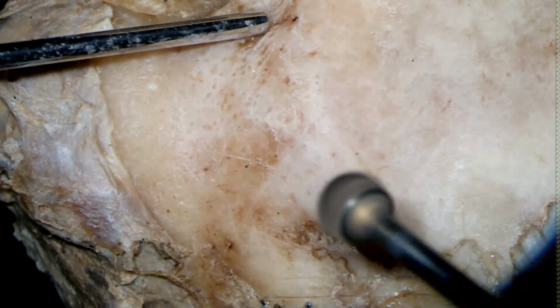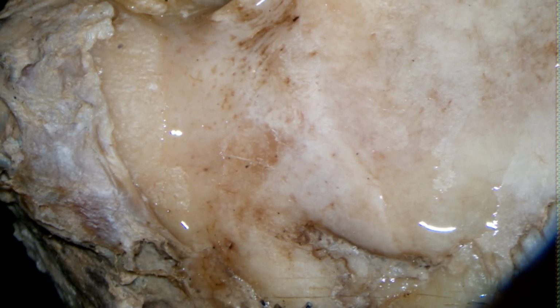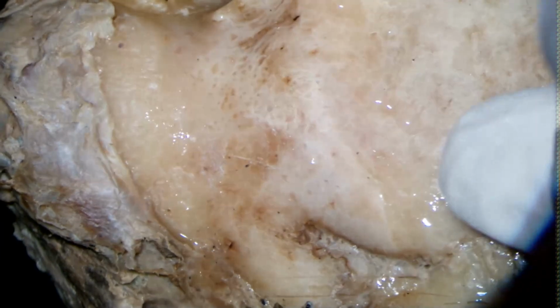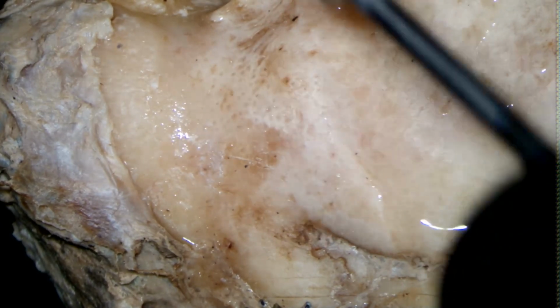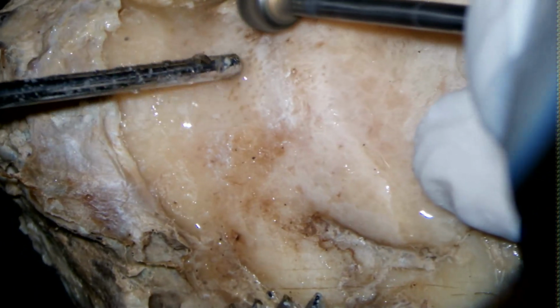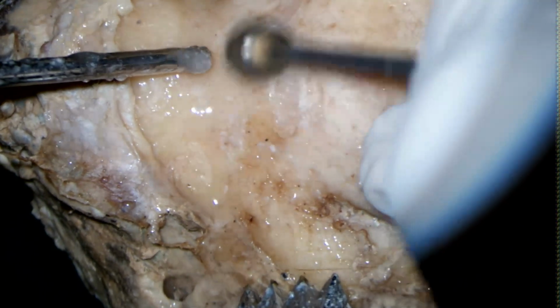So we'll start with the marking of the triangle of attack. So suprameatal triangle and triangle of attack are slightly different. Suprameatal triangle is basically the McEwen's triangle, right? But triangle of attack is a larger triangle which is bounded by the posterior canal wall, the inferior temporal line, and the sigmoid sinus, right? So that is the triangle of attack, right? So we'll start drilling, and we'll mark the. This is a hard bone here, very hard. Okay. So this is the superior limit.